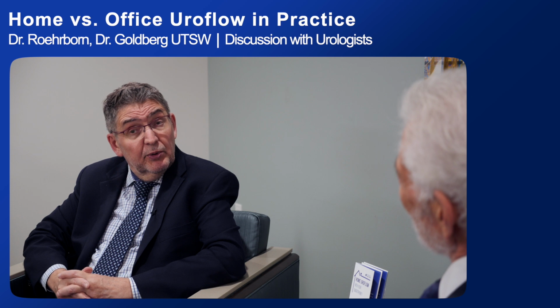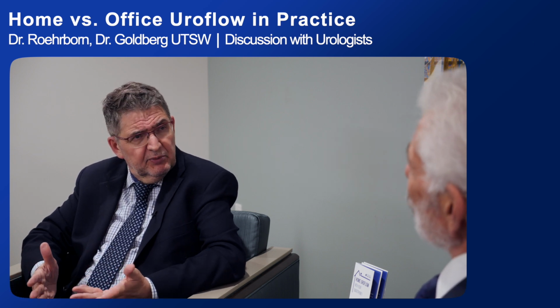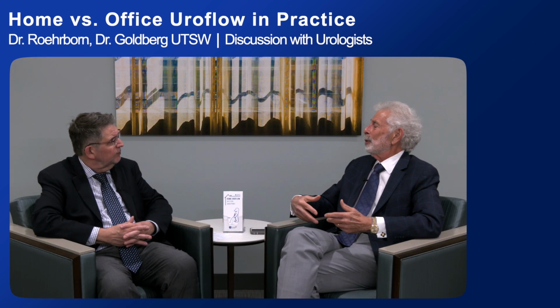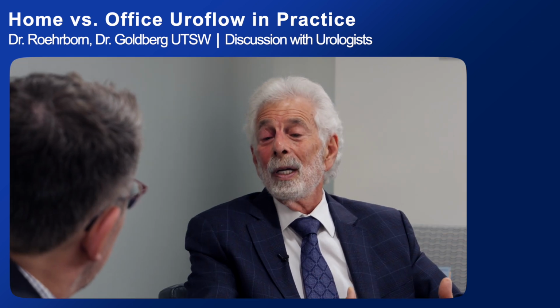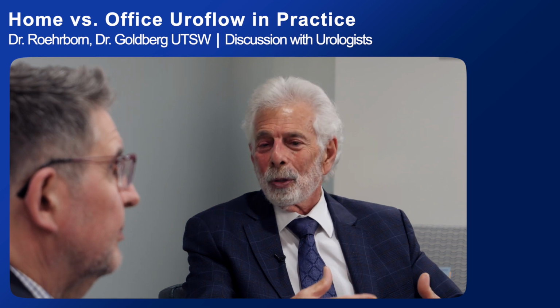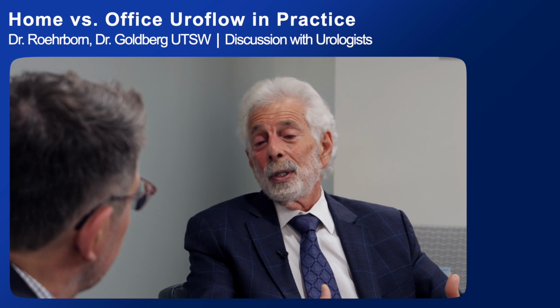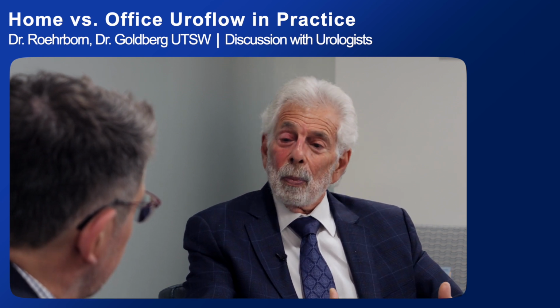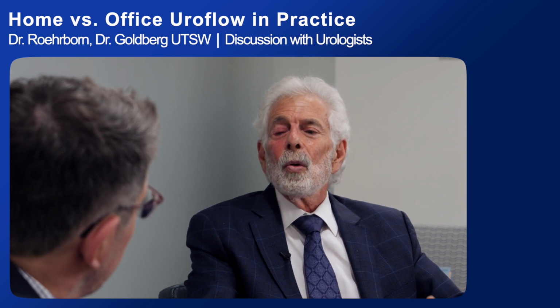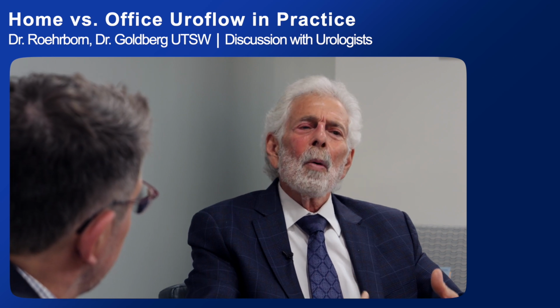But there is monitoring, at least let's just say before and after surgical treatment, or is that certainly what you'll do? There should be, for sure. I think to try to determine if you think you can help someone, you have to identify what his real problem is. We all know most men have an issue with nocturia as their main complaint, but how many of them really have an obstruction that needs to be dealt with from an interventional point of view? So I rely, certainly, I won't do any procedure on anyone without it, unless they're obviously in retention, then there's not necessarily a need, but otherwise we do.